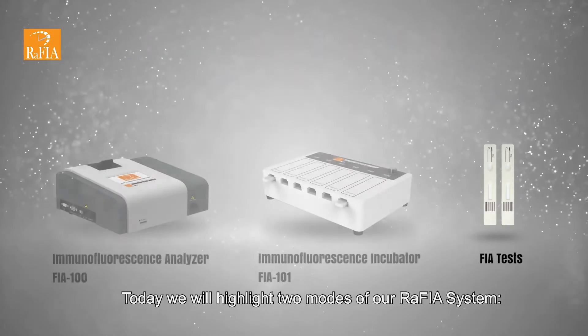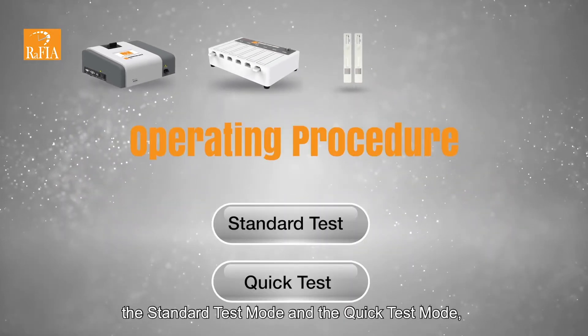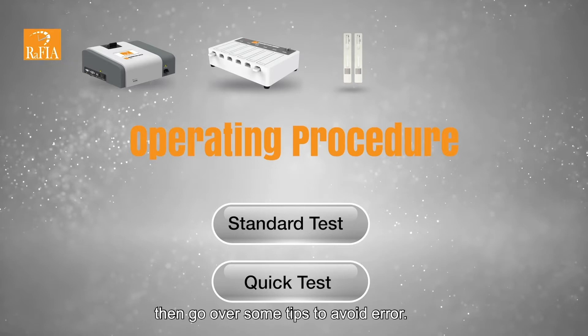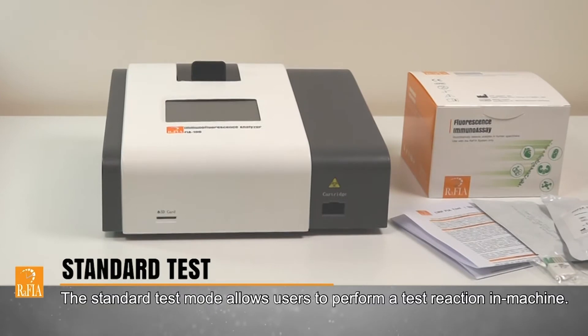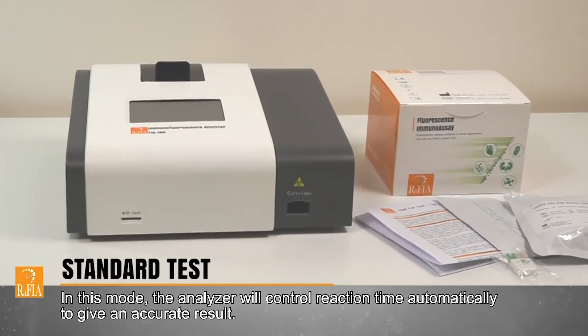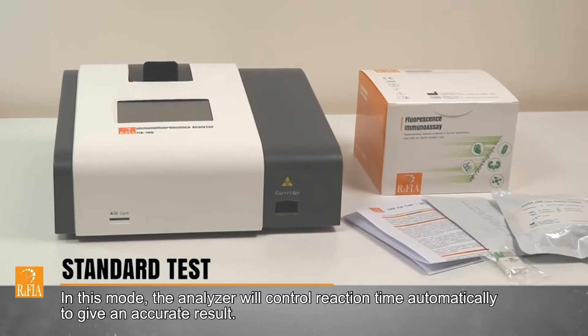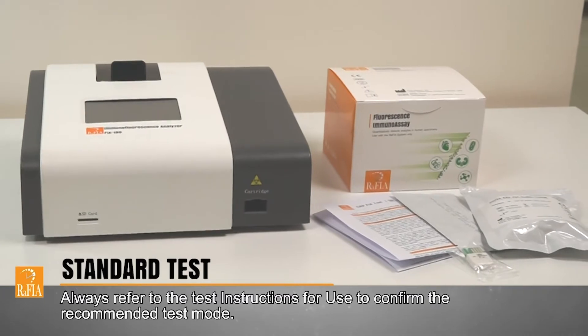Today we will highlight two modes of our RAFIA system: the standard test mode and the quick test mode, then go over some tips to avoid error. The standard test mode allows users to perform a test reaction in the machine. In this mode, the analyzer will control reaction time automatically to give an accurate result. Always refer to the test instructions for use to confirm the recommended test mode.